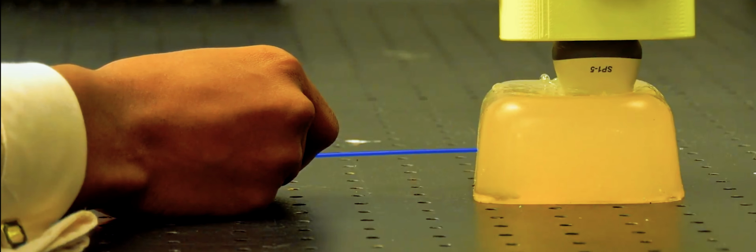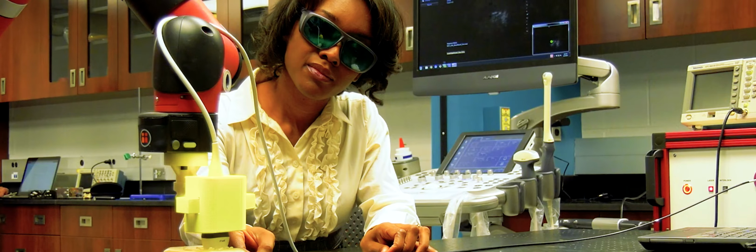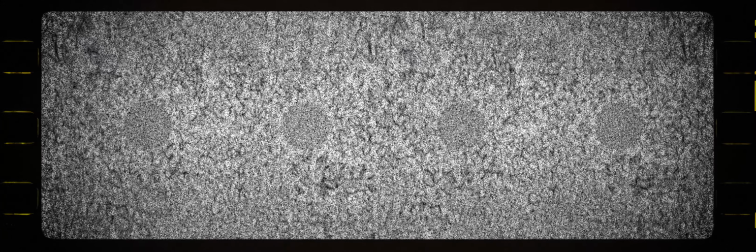I made the first SLSC image in 2009. Using a model biomaterial, Bell simulated a test subject's tissues with undiagnosed masses beneath the skin. I knew there should be a series of water-filled cysts in a line in a row. What we instead saw with traditional images were some grayish circles instead of black because of the clutter. But when Bell turned on the machine, there was no doubt. The 4 little circles were black.